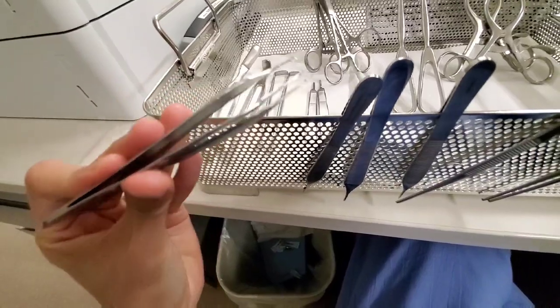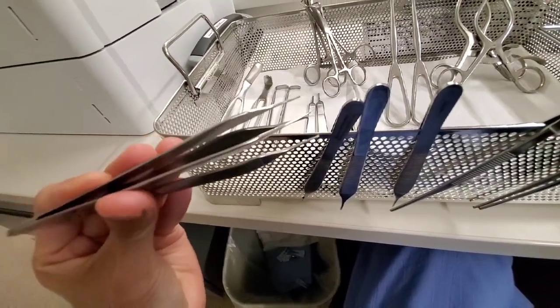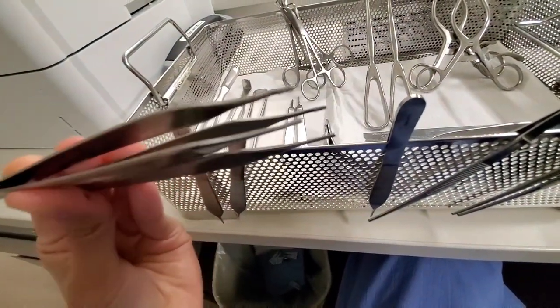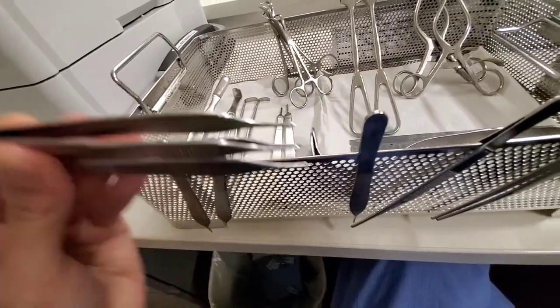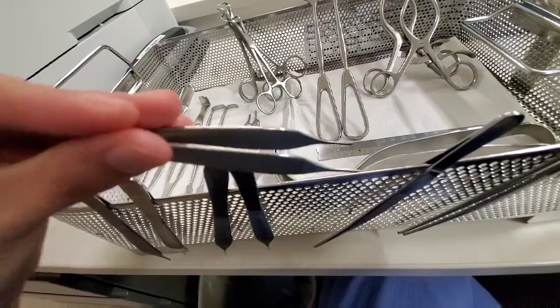These are called Adson with teeth. These are called Adson Browns — you can see they have really tiny teeth in there, but you can't tell from this angle. This is Adson no teeth.